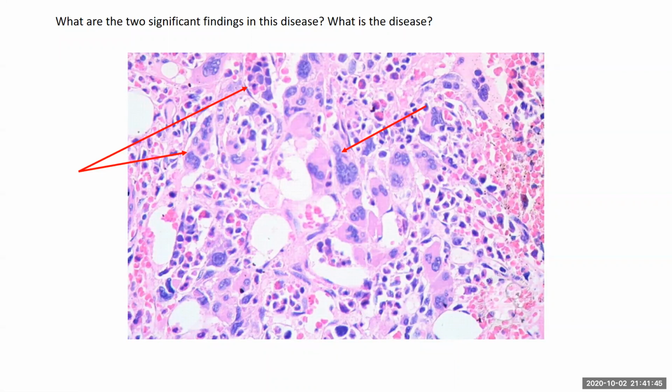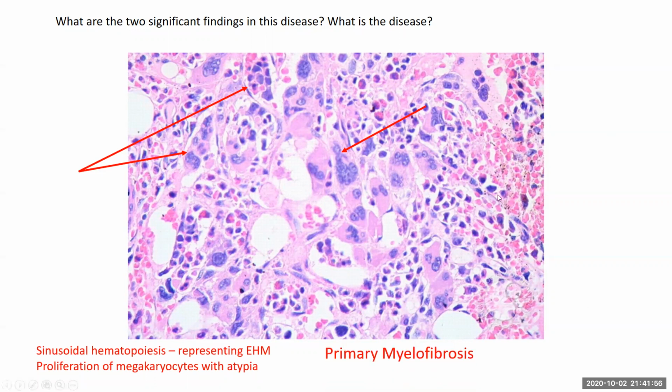PV. Well, polycythemia vera. ET. This would actually be PMF. So let me go one more. Granted, the findings sometimes overlap, but a lot of it is going to come down to morphology, and we never make the diagnosis of essential thrombocythemia here, ET.